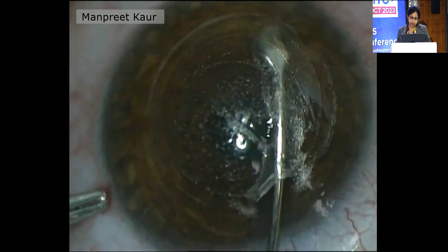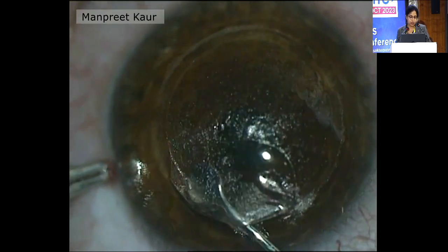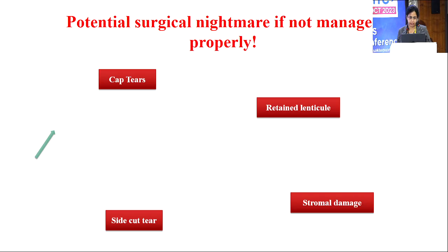So it is going very smoothly. There is no side cut extension. It's a 2 mm side cut, and I don't even need to use a forceps to extract. More important than panicking is just knowing which plane you have dissected first and then managing accordingly.